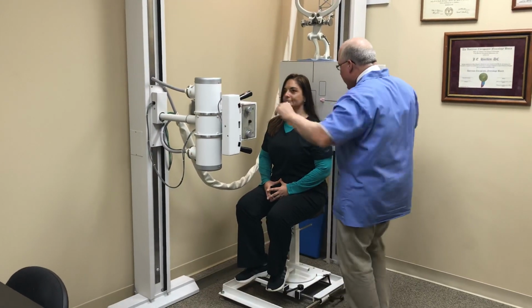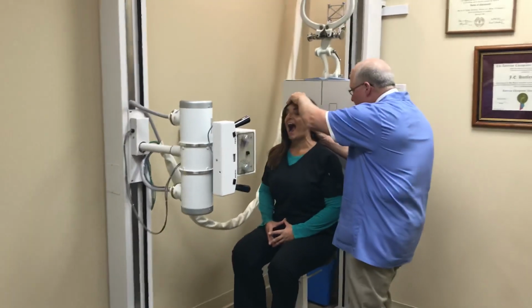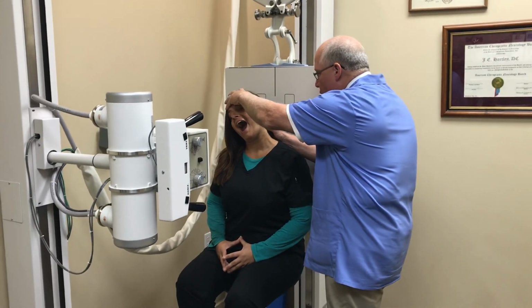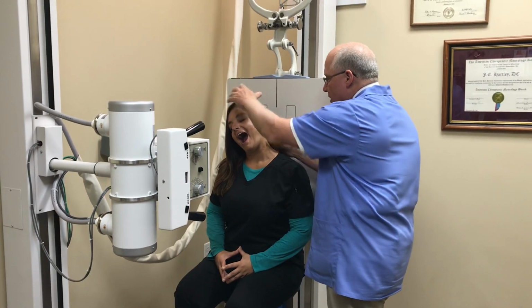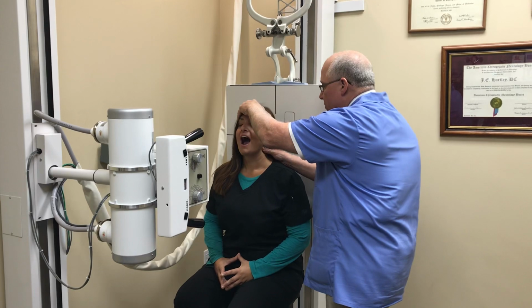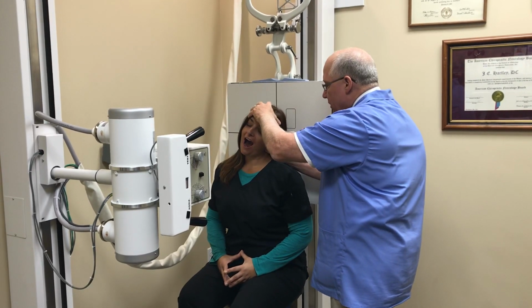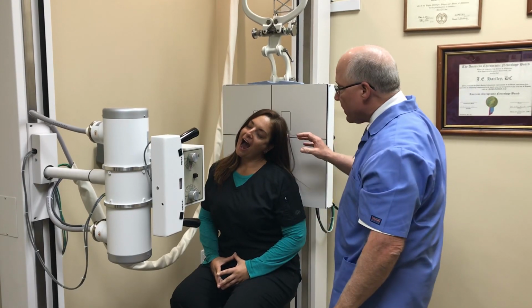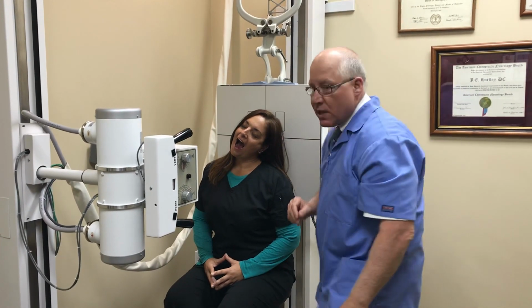Okay, you're going to open your mouth as wide as you can, chin down a little bit, tip your head to the right. So this is called the right cervical flexion or right alar view. We're going to take the x-ray there, look up to the ceiling, head to the left, chin down a little bit. And we're going to take the x-ray there. That's left cervical flexion or left alar view. So now we're going to look at the results of that.